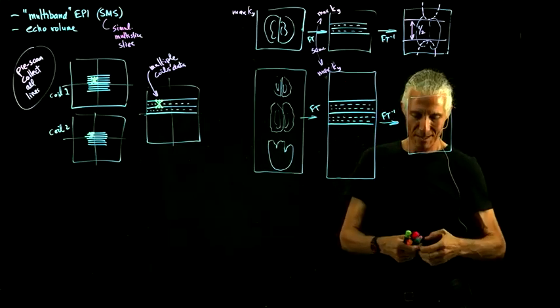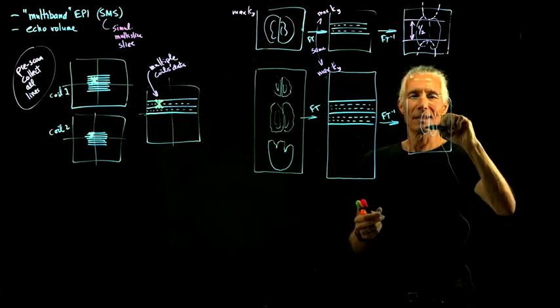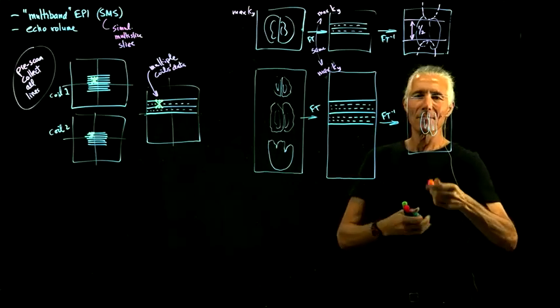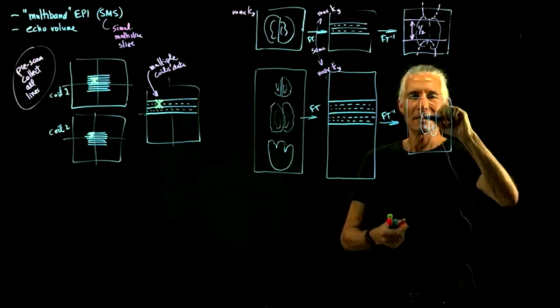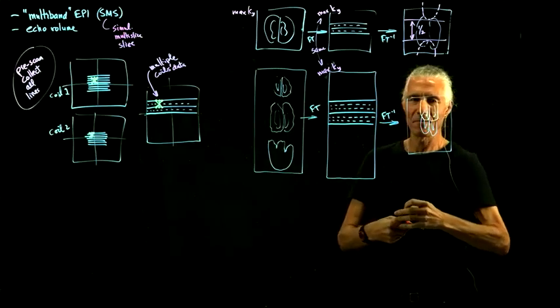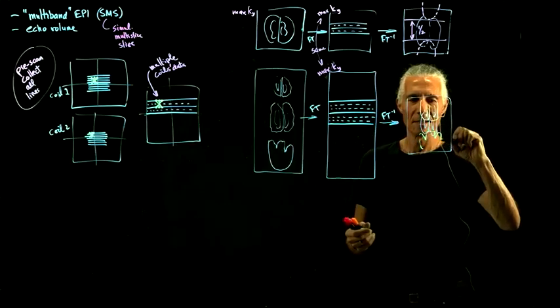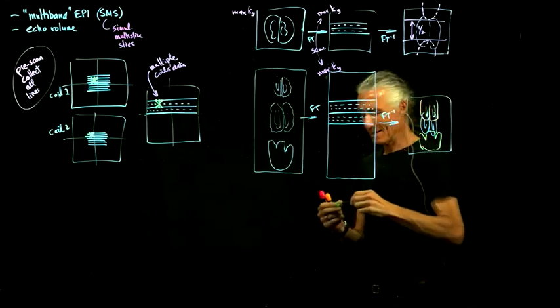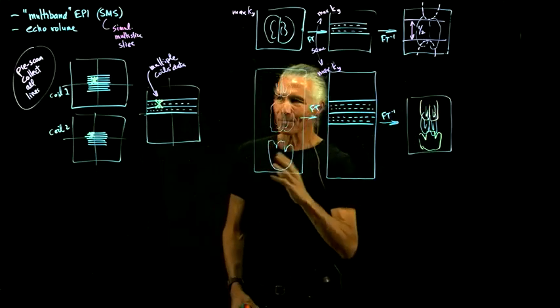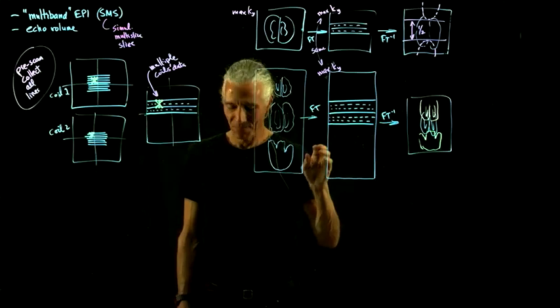We would see 1 slice here, and then there would be another slice on top of it, and another slice on top of that, like say some temporal lobes. So we would see 3 slices on top. However, we actually recorded all the data. We didn't leave out any slices.